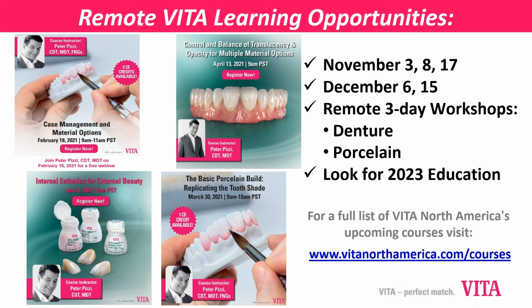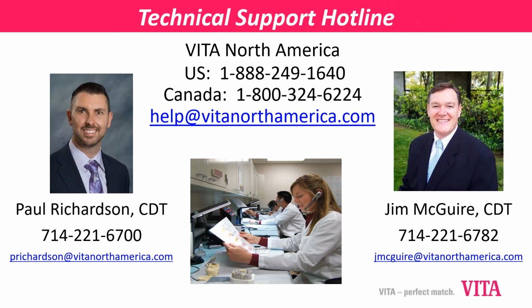Mohammed had a follow-up. Would it be possible to use that spectrophotometer, the VITA Easy Shade, for that dark tooth? I don't know the right answer for that, Mohammed. I would say probably not, because for one, if it's at the cervical or at the proximal, it's a little hard to get the Easy Shade, the angulations that you need.